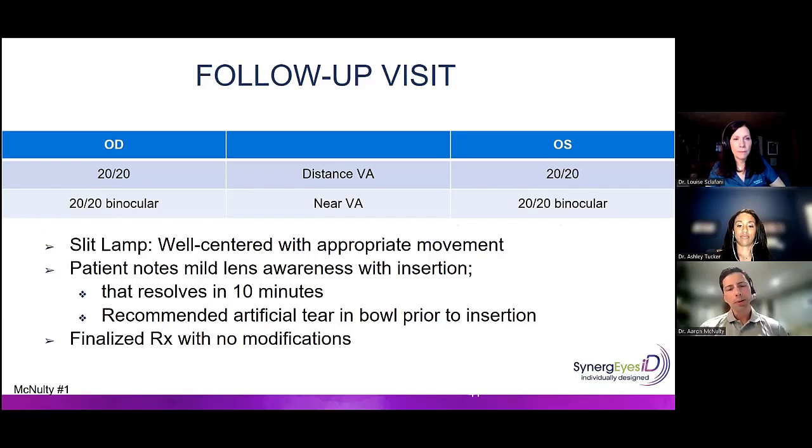At the follow-up, she said that when she puts them in, a lot of days, for 5 to 10 minutes she can kind of feel them. They're not painful, but she's aware of them. And then she goes about her day with no issues. I just had her put an artificial tear into the lens prior to insertion to help create a little bit of a buffer, and that was helpful for that complaint. I didn't need any modifications. Again, this was just like the Staples easy button, just stupidly simple to get us eased into this discussion. With this lens, it was easy. It really doesn't speak to my abilities any.